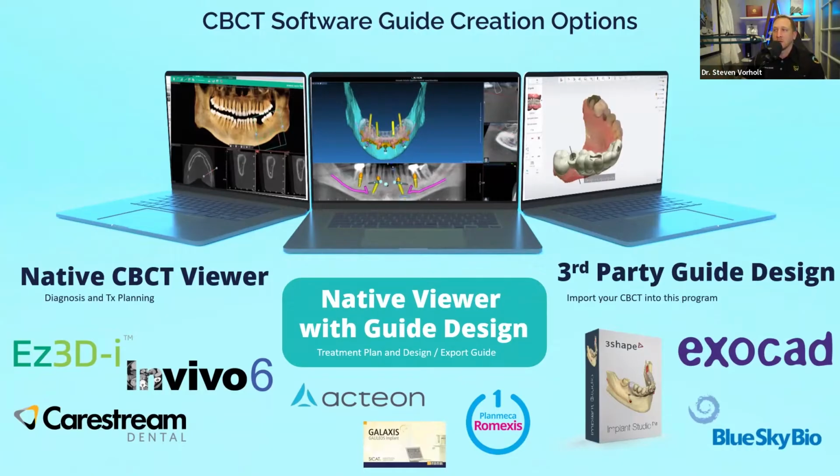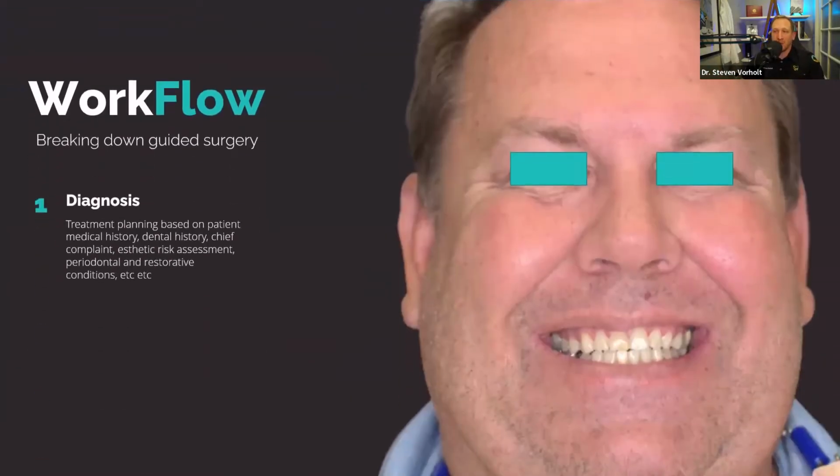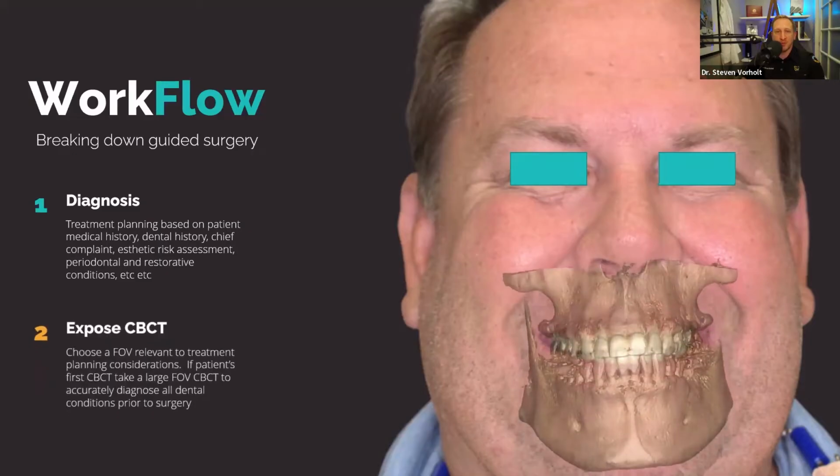Okay, so let's take a look at my Acteon workflow and how it works in my practice. So generally, the diagnosis happens based on the patient's medical history, dental history, chief complaint, et cetera, and all their conditions. And so now we're going to expose the CBCT.